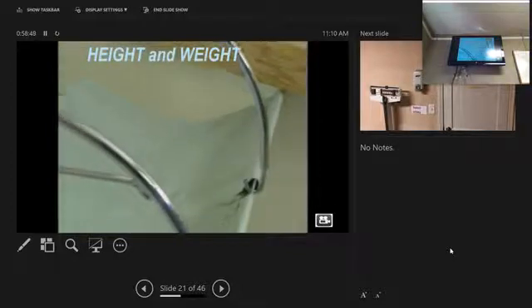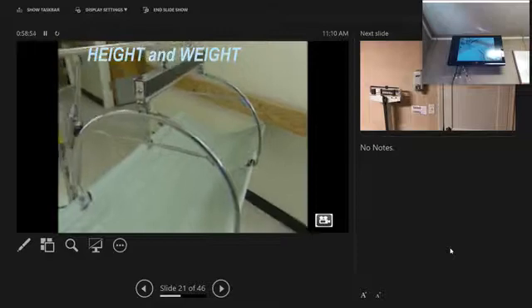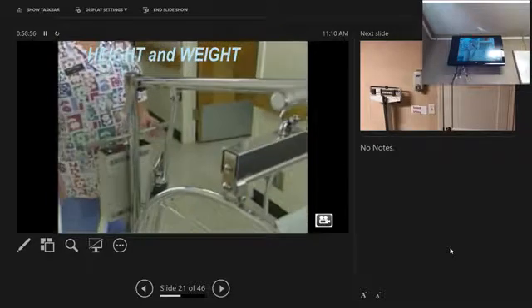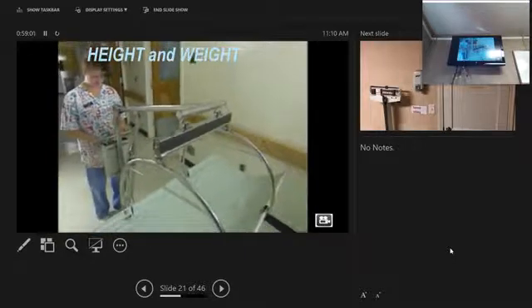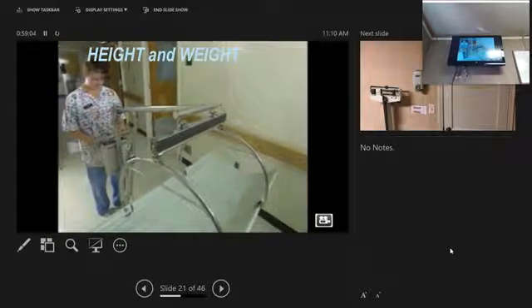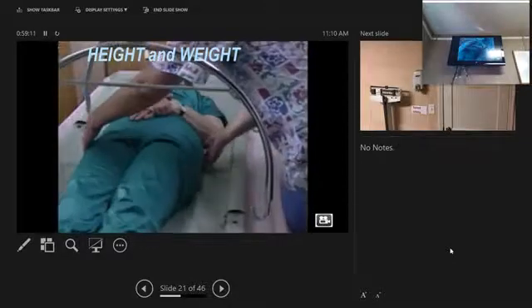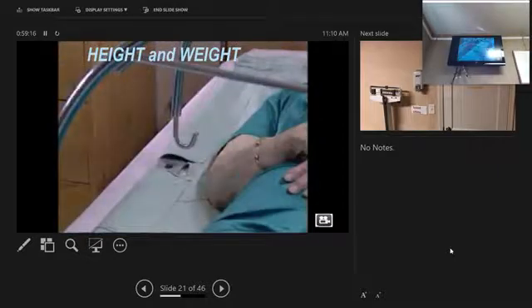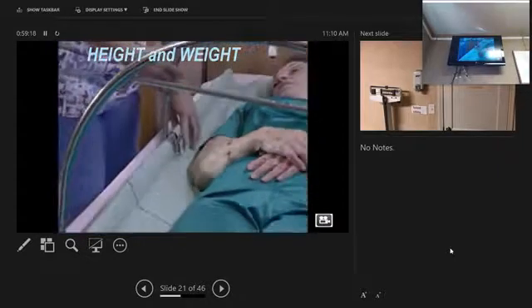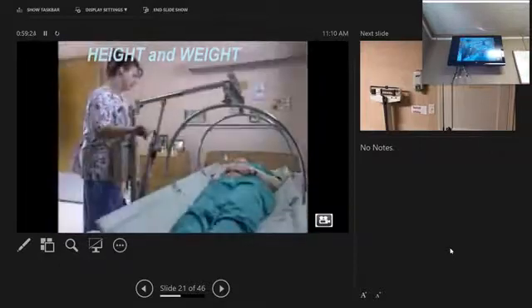A bed scale is used for residents who cannot stand and cannot sit in a wheelchair. Before weighing the resident using this method, perform your beginning procedure actions. To accurately balance the scale, do so with the canvas sheet, chains, or straps attached. Remove the sling and position the resident on it. Connect the straps and elevate the lift above the level of the bed. Raise the sling so the resident's body and the sling hang freely over the bed.